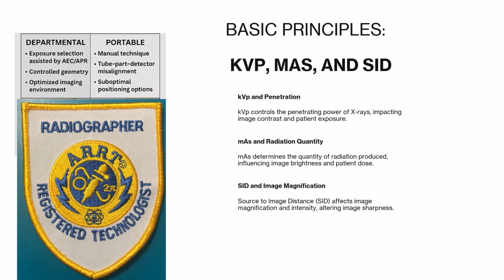Back to the basics. We have to crawl before we walk. kVp controls the penetrating power of X-rays, and mAs determines the quantity of radiation, while source to image distance, or SID, affects image magnification and intensity. Adjusting these factors manually influences image quality and patient dose.